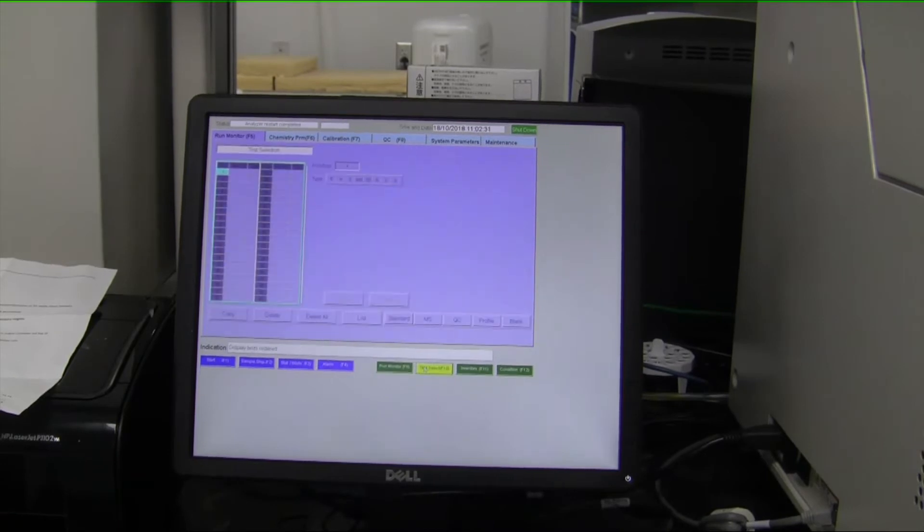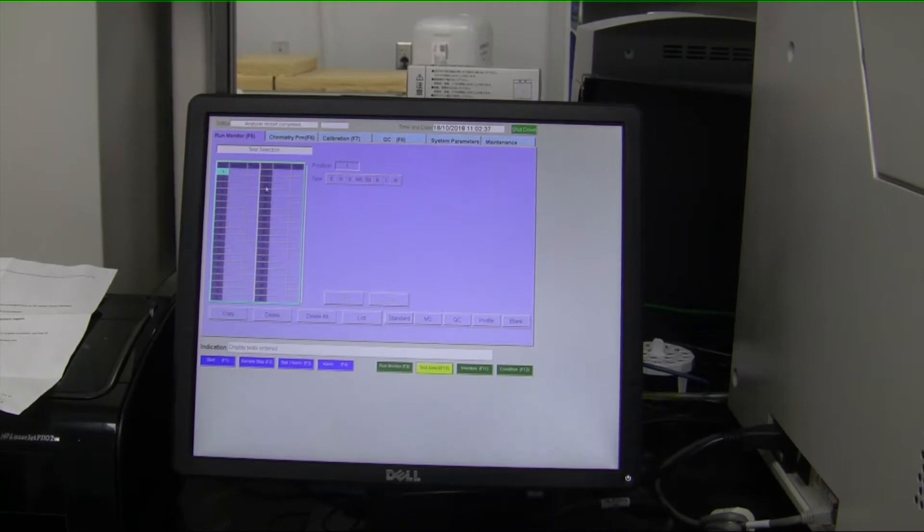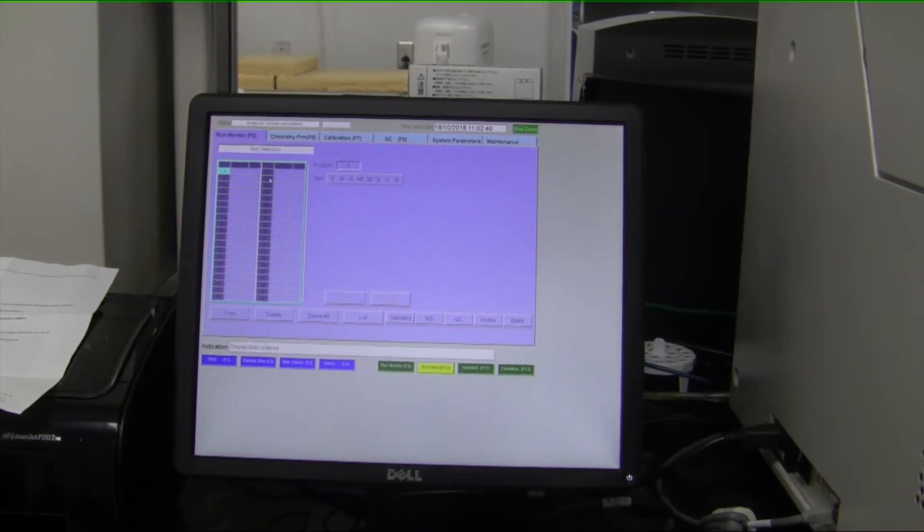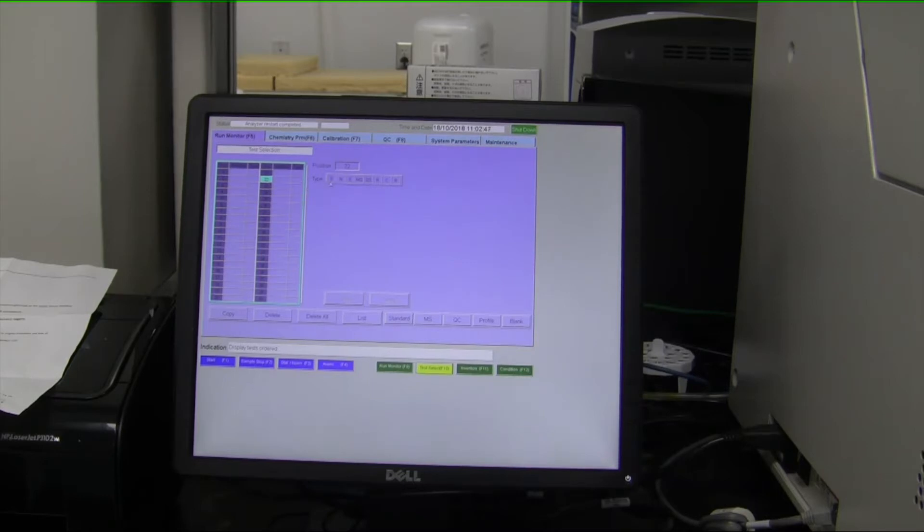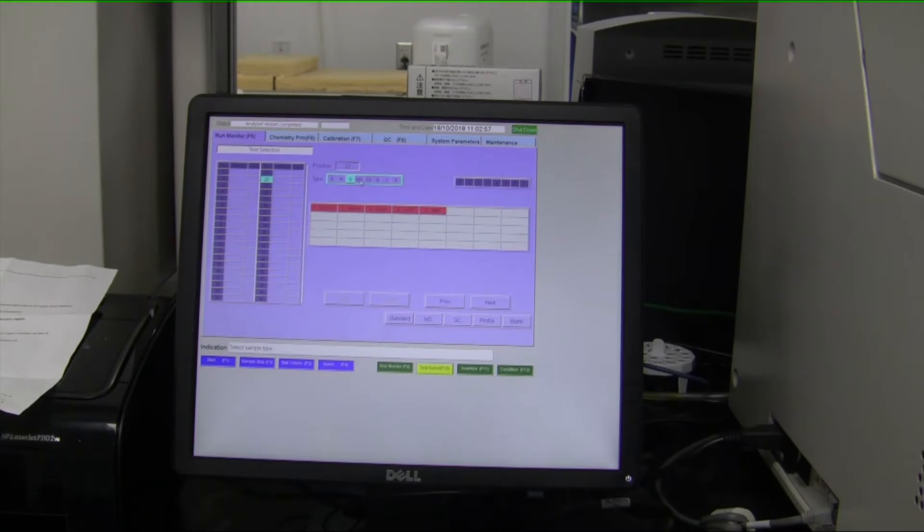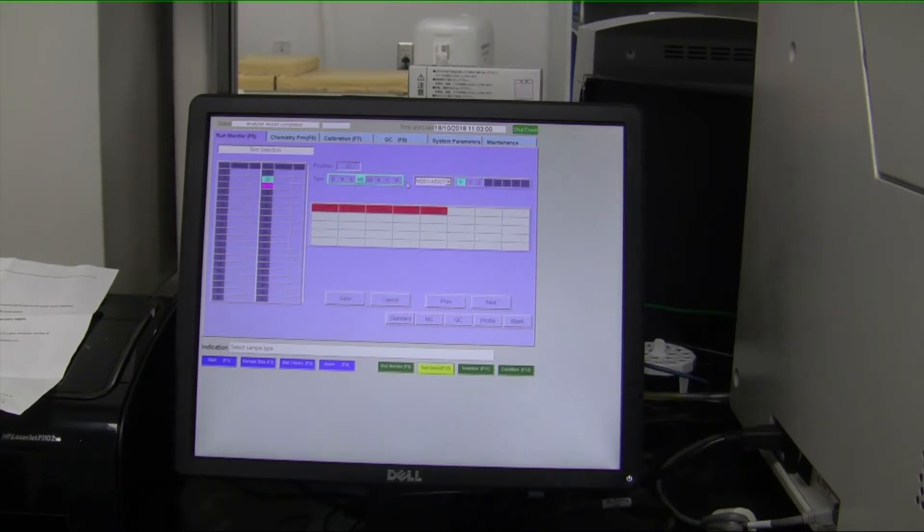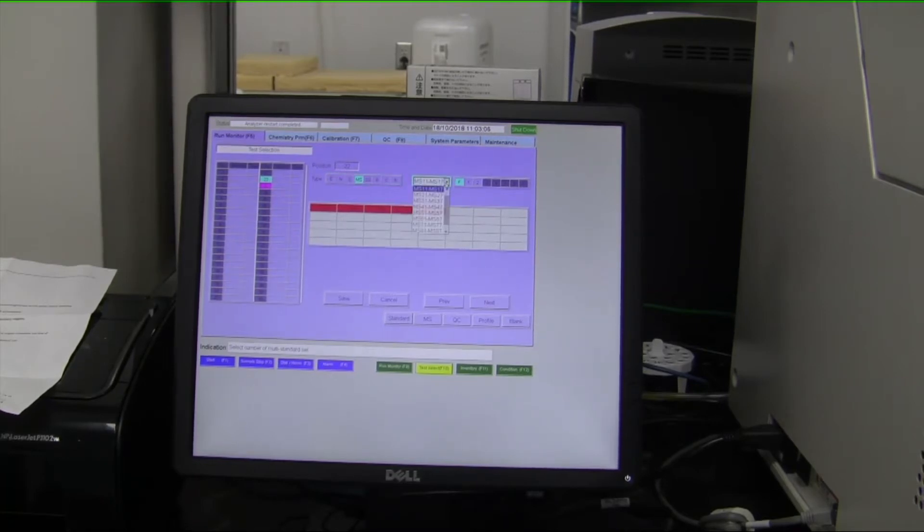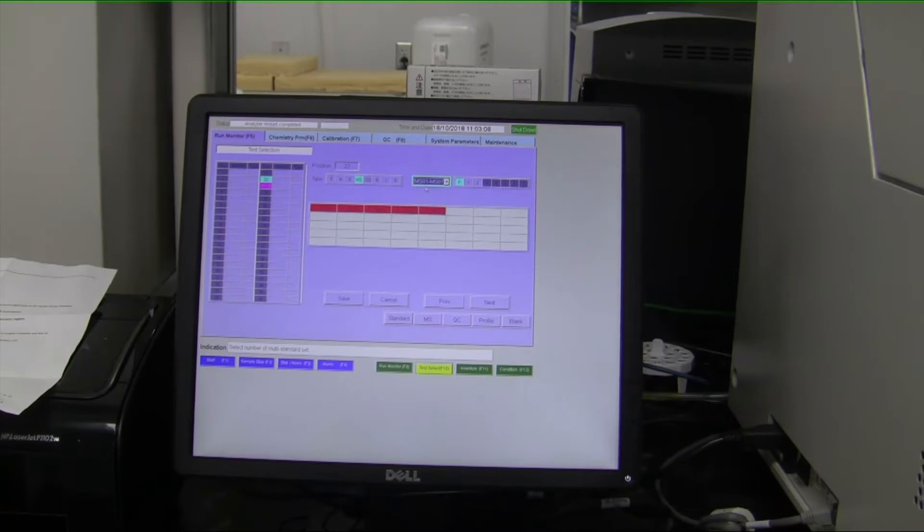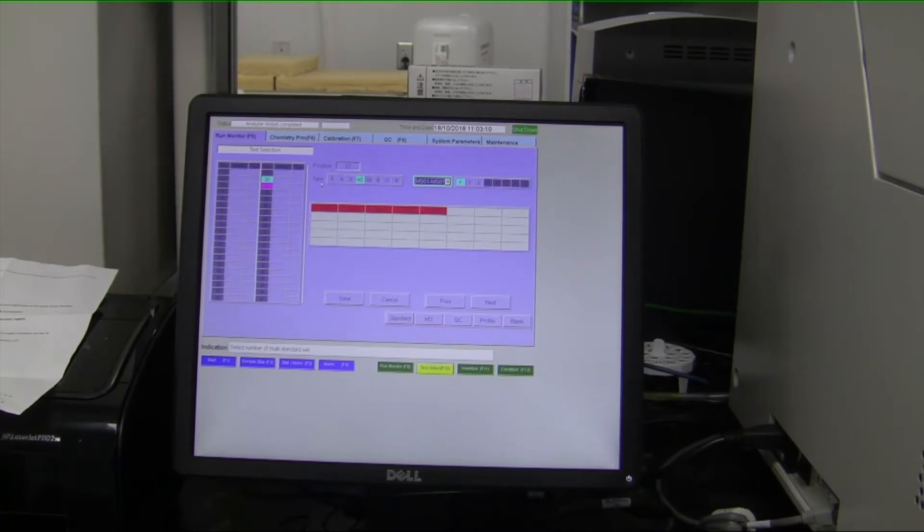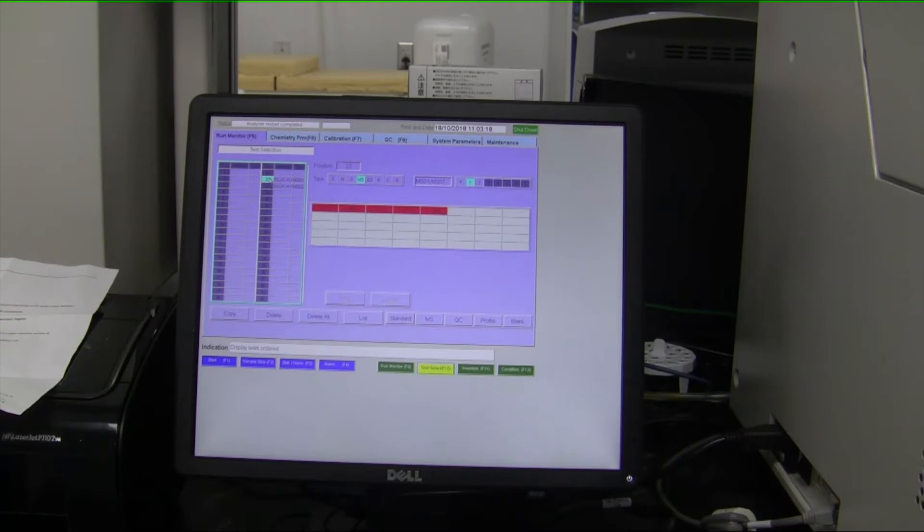If we go back to the test selection area, you have 40 sample positions here. All you have to do is highlight a specific position. You can put your sample cups anywhere you prefer. Let's just say, for example, we were going to run a calibration in position number 22. Over here you have the sample types, so N is for normal sample type, S is for a calibration of a single metabolite, MS is for multiple metabolites calibration. Over here you have the specific name of each calibrator that could be onboard. Once you select the name, you just click the save button and you'll see it automatically populated two positions.